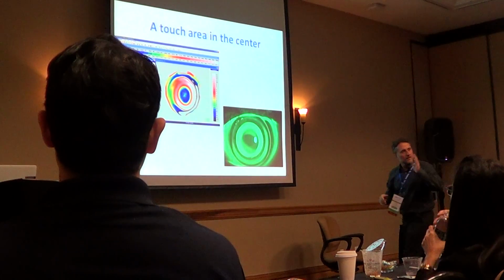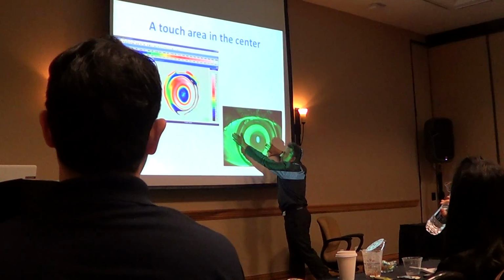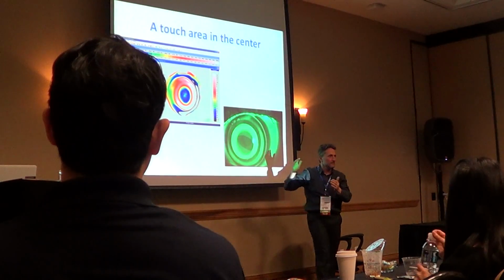Okay, again Jeff, first, center, second, alignment curve for nasal temporal, alignment curve for vertical inferior, third, total diameter, okay? Right.